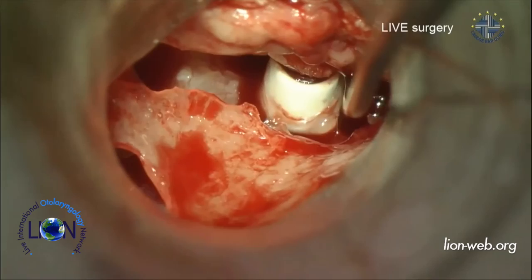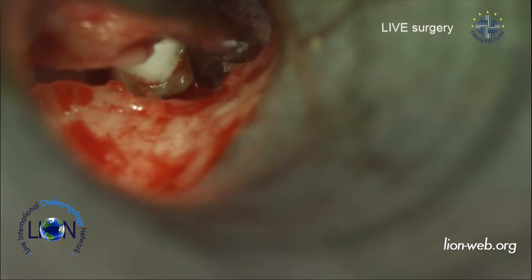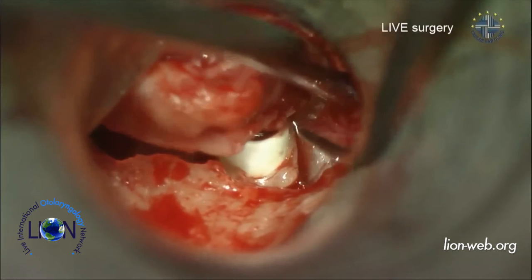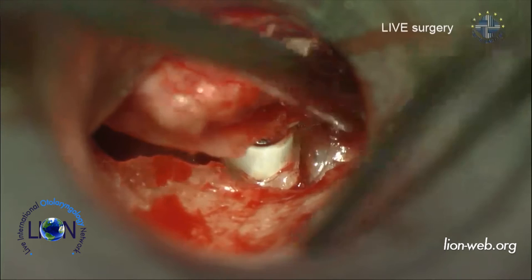Robert, can you see if there's a reflex or if it's... No, we can't see that. It'd be interesting. I'm sure there is, but... Not the round window. No. Not really. Maybe we can see, but I'm sure if I push the prosthesis, you will see the round window sign. It'd be interesting to know whether Chris has had the same problem with this prosthesis. Yeah, you see the round window sign? Which one? Here.